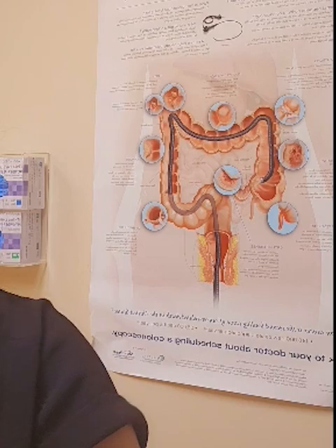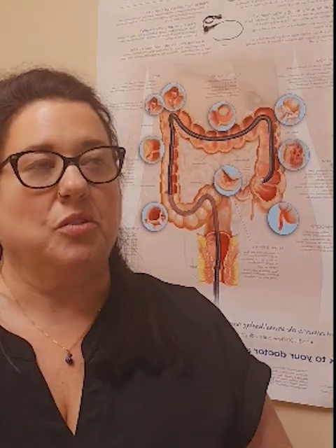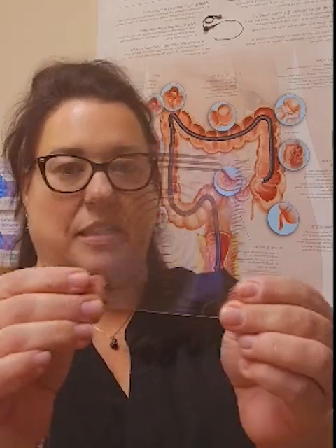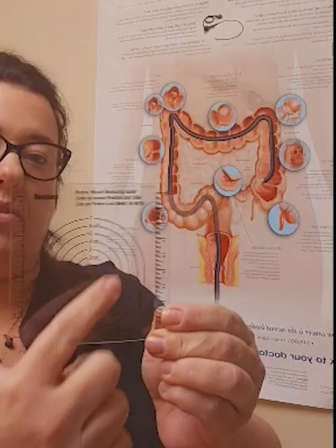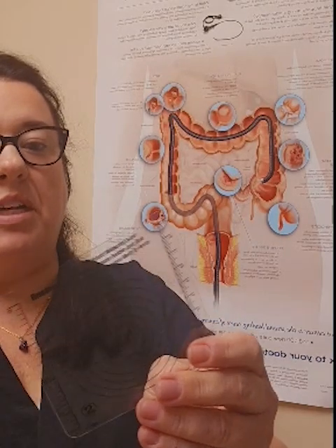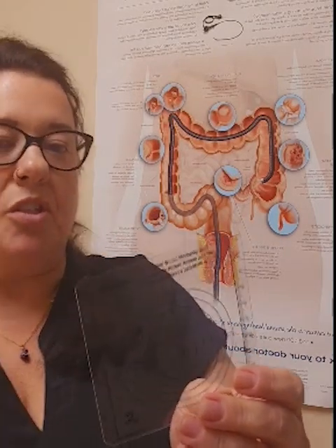With the stoma, when it's new, the stoma will be a little bit larger due to the surgical intervention and swelling. Just as any time surgery is done, the body reacts and there may be some inflammation, and that's true in the case of a stoma as well. So measuring the stoma is a great thing to do every time you change the ostomy appliance. This scale here, which we were going to use for a template, also has a measuring device on each end so that you can measure and keep track of your stoma size.